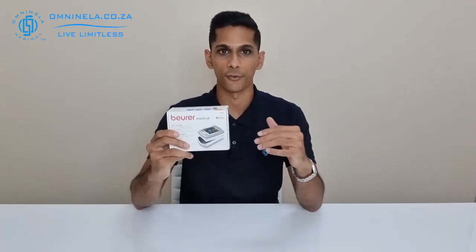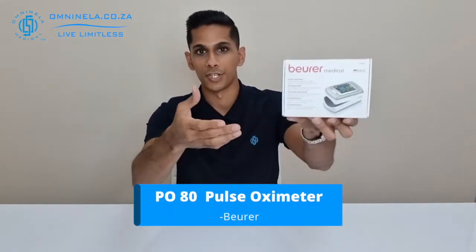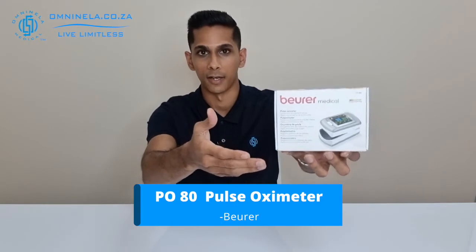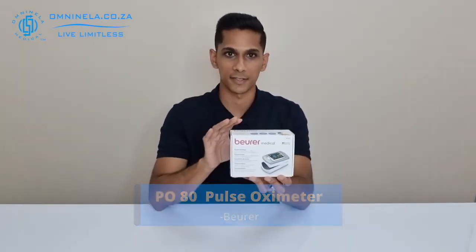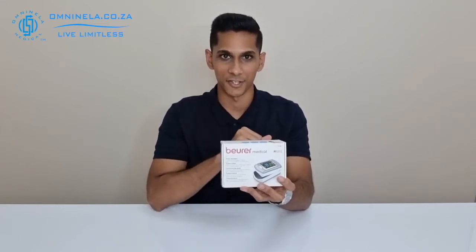If your doctor has recommended you to get a pulse oximeter and you've been looking around for a device that's reliable, accurate, and also has a few features that you may not find on any other pulse oximeter out there, then this would be a video that you'd want to watch. Today we're going to unbox the PO80, which is Boyer's premium line of their pulse oximeters, and have a quick look at the features and what items come included inside the packaging.